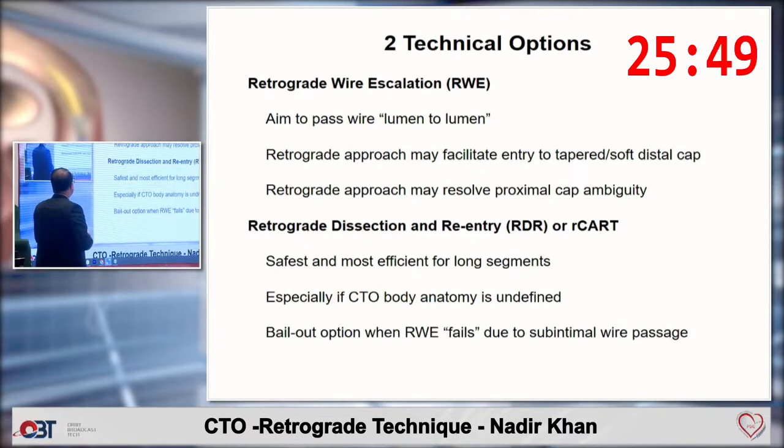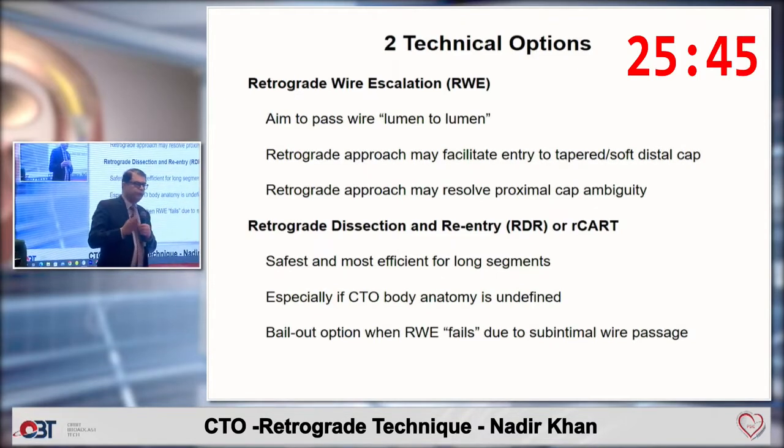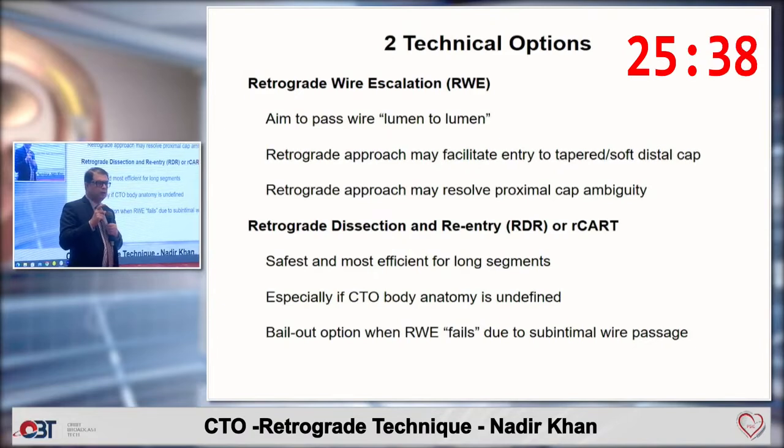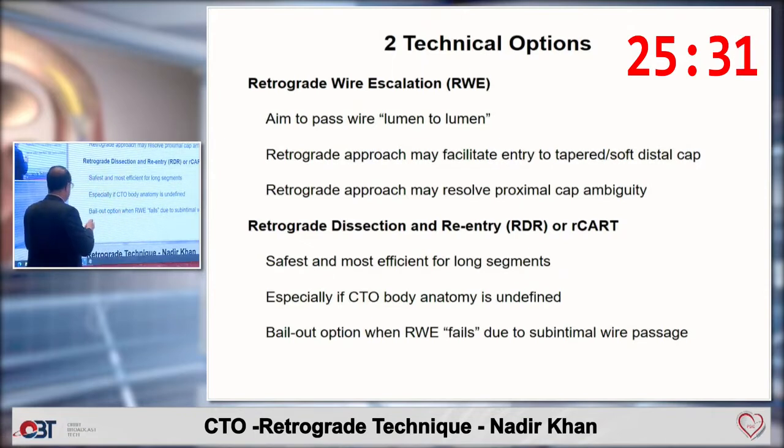Now, the same principles apply to retrograde wire escalation which apply to antegrade wire escalation. So if you have a small CTO, less than 20 millimeters, you can use retrograde wire escalation. But if you have a long segment CTO, then reverse CART is probably a more efficient CTO technique.